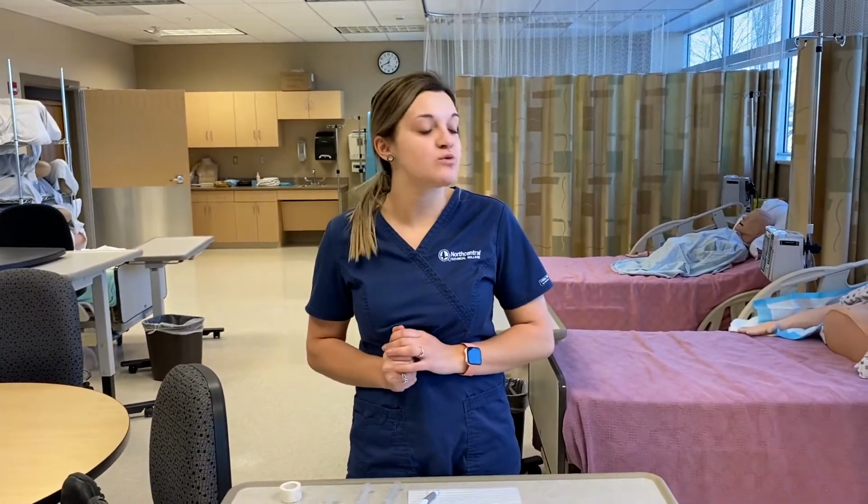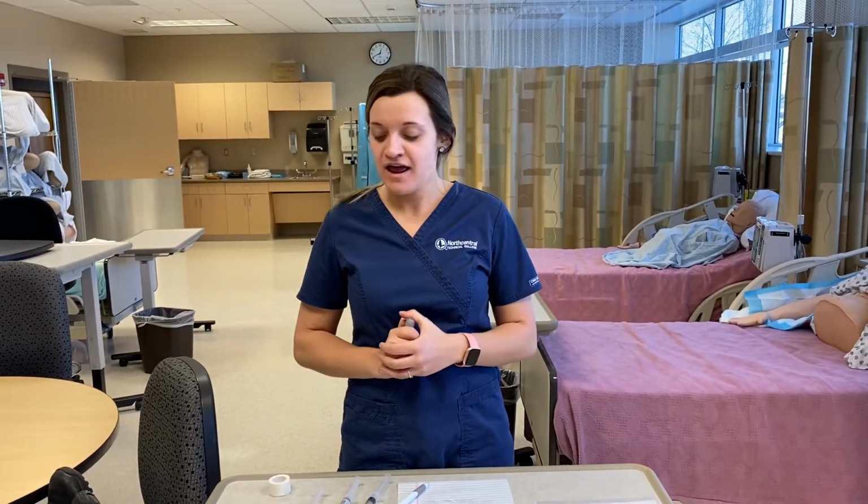Hi, I'm McKenna. I am going to be demonstrating how to give a medication IV push via central line.